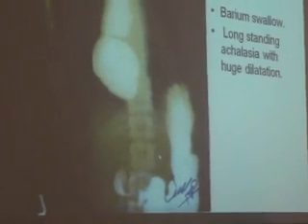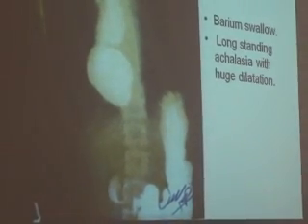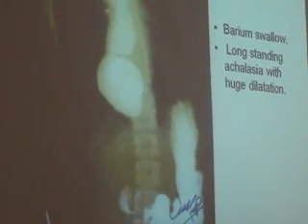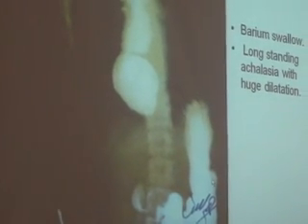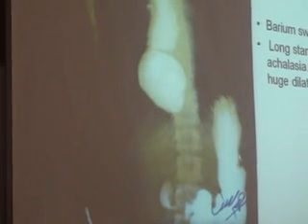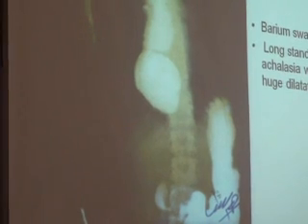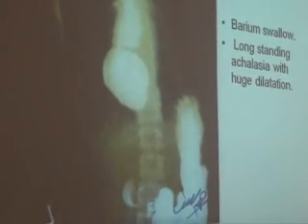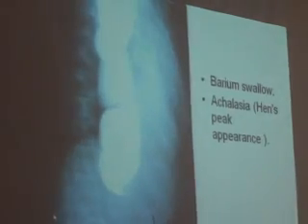There are no specific pathological findings in this esophagus or stomach. This is the greater curvature. There is a peristaltic movement — another peristaltic movement. Two restrictions on opposite sides is normal. If you find a crater, notch, or niche it is abnormal, but two restrictions on both sides is a normal constriction. This is the pyloric antrum, pyloric canal, pyloric sphincter, and the duodenal cap. Another achalasia of the cardia — all these X-rays show achalasia of the cardia.